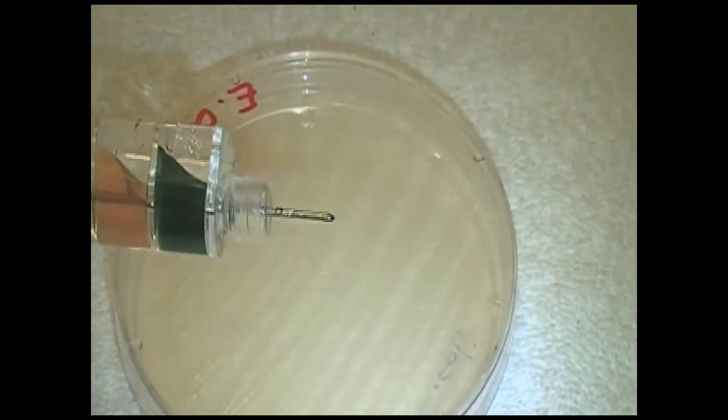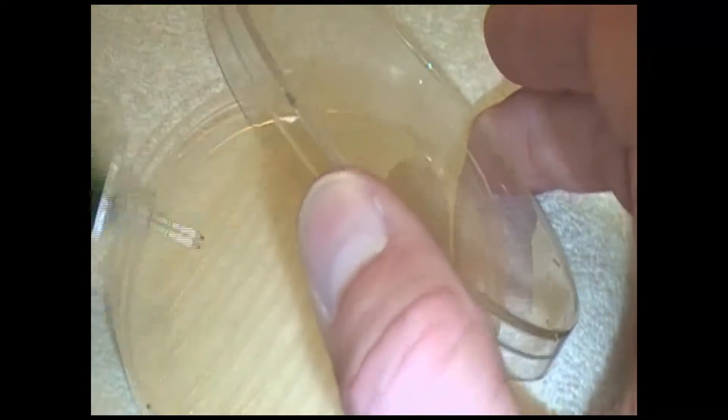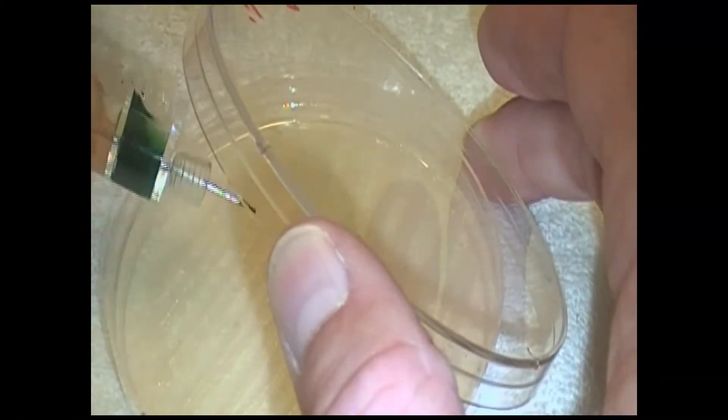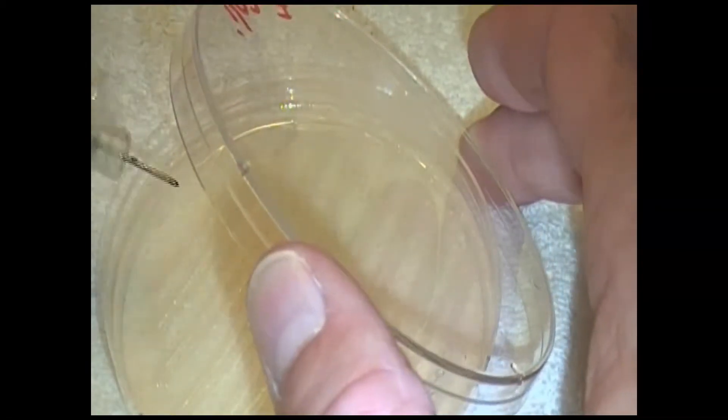That's going to expose our needle. We take our petri dish. We are going to open it up, and we don't want to open it up too much. Then we are going to come in here, and we are going to rub the needle on some colony to get the colony on it.